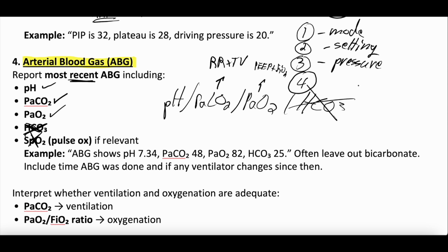So we're going to stack all these together. Hopefully we don't start to forget things. We certainly might. But you can say, patient X is on volume control. Ventilator settings are 18, 450, which is about 6 cc's per kg of ideal body weight.